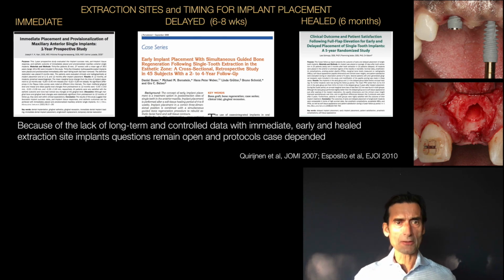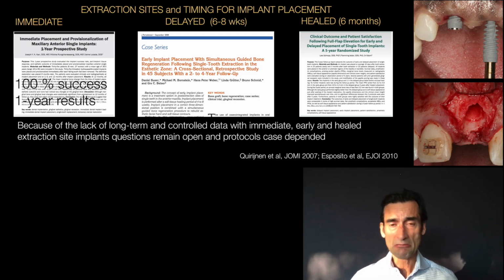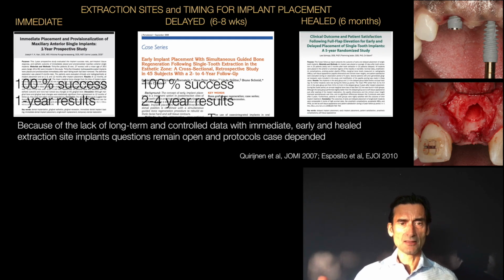Now, when we look at scientific documentation on these time points for implant placement, it's interesting because if I look at immediate and the success rate of implants that are placed immediately at extraction site, it seems to be, at least in this clinical documentation, very high, 100% success, but it's a short follow-up. But other documentations have shown that, and I can certainly support this in a well-selected and, let's say, healthy patient.